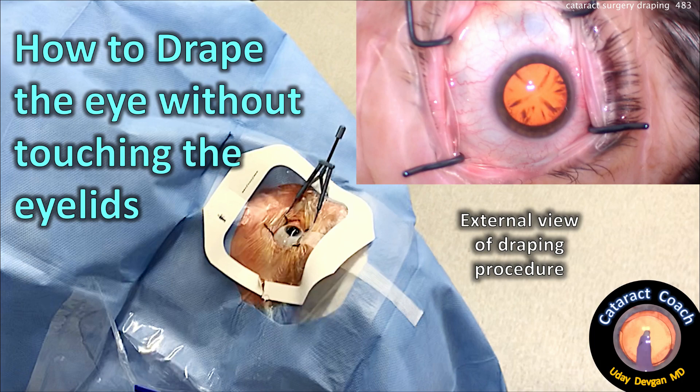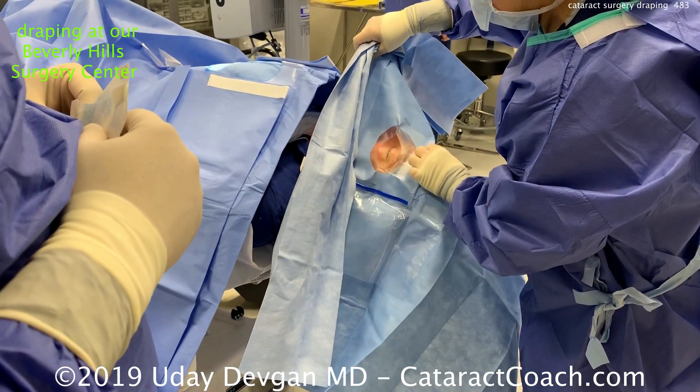CataractCoach.com. How to drape the eye without touching the eyelids for cataract surgery. Let me show you my technique — here's how we do it at our Beverly Hills Surgery Center.